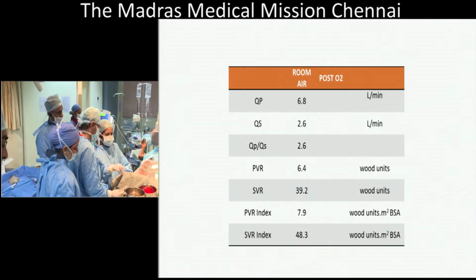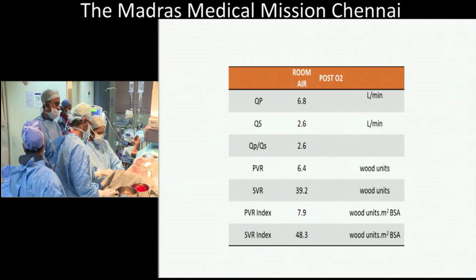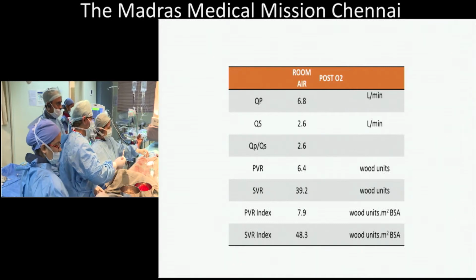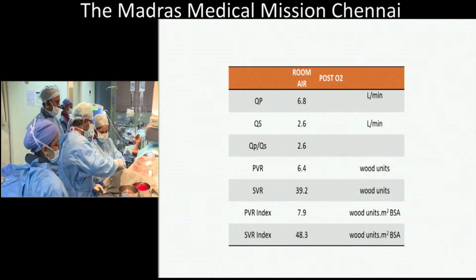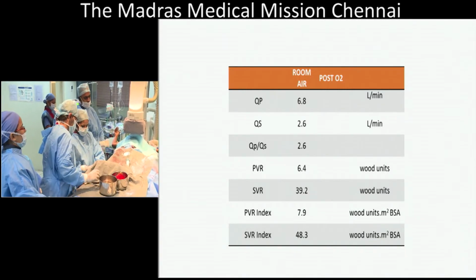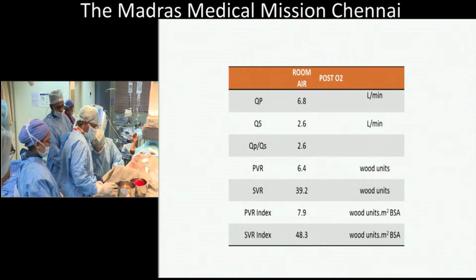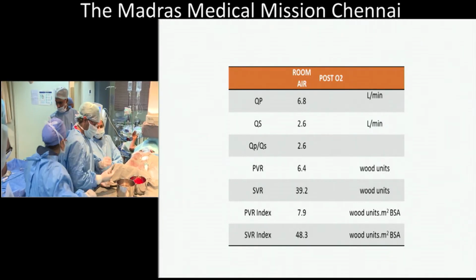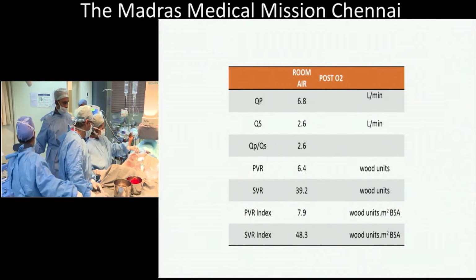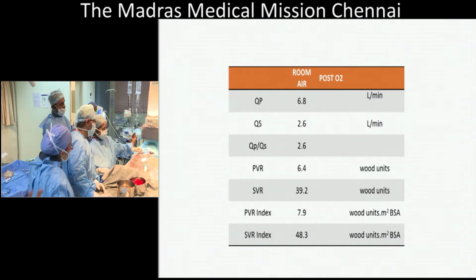It's a comment. I believe that most of the patients like this do well after closure. But in a very small portion of patients, they may show some aggravation or less improvement after closure. So we should be careful. If you close 100 patients like this, and you experience 3-4 patients who have a significant residual pulmonary arterial hypertension, it's going to be a problem. So I would definitely close with the fenestrated. Okay.